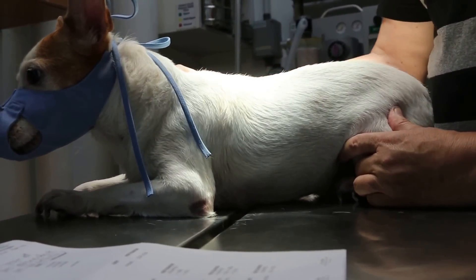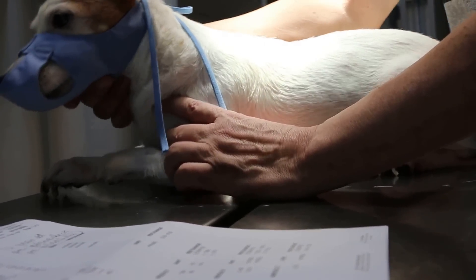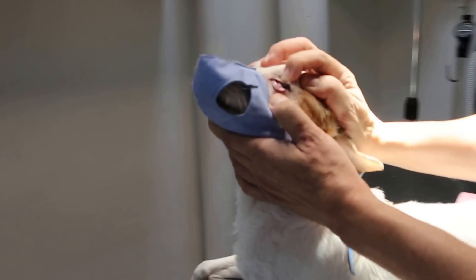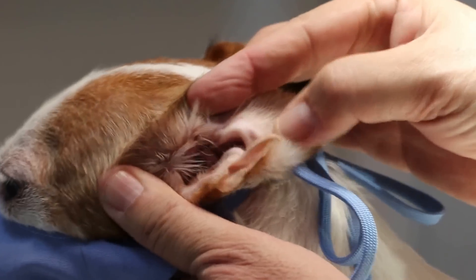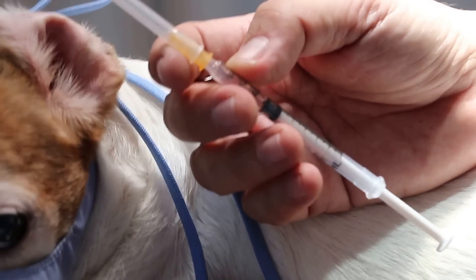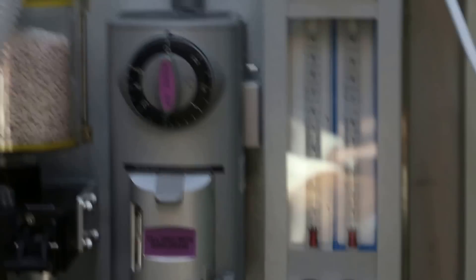This dog is actually quite healthy — no loss of appetite, no drinking more or less, no diarrhea or vomiting — so we are going to do the operation today. The ears have been cleaned. I am using Domitor plus ketamine and then isoflurane gas. Another procedure we have to do is the anesthesia and surgery record.